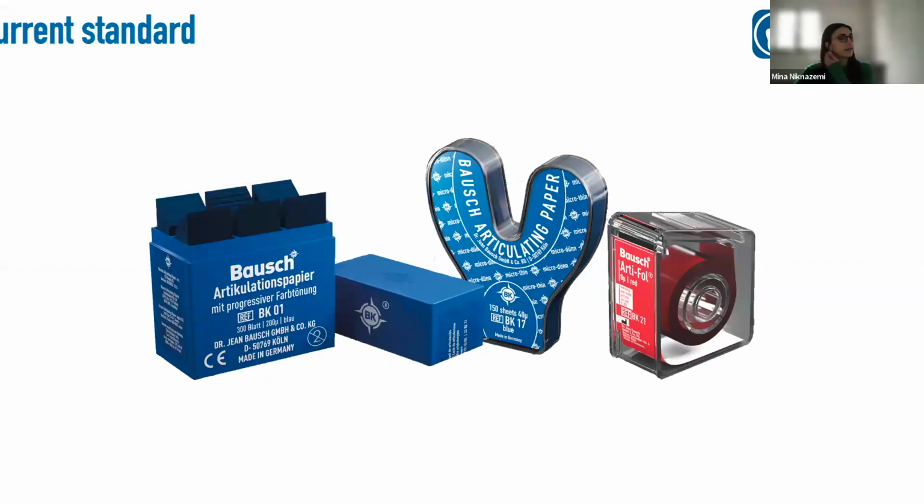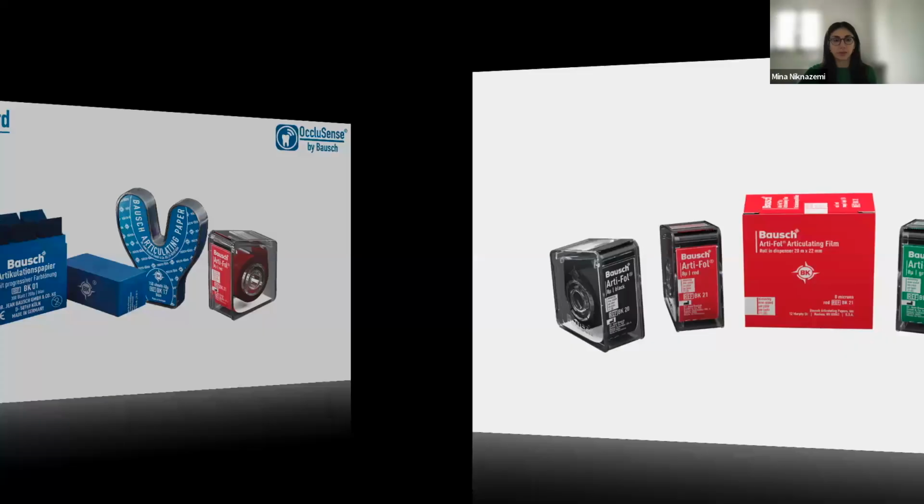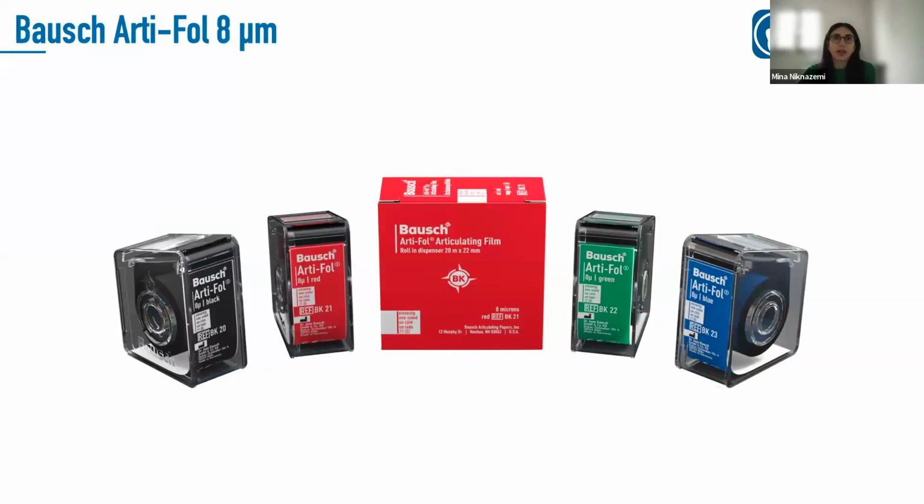We know that the current standard involves standard articulating paper in different shapes. You have pre-cut strips, you have occlusion paper covering the full dental arch, and you have occlusion paper rolled and ready to be cut in sizes as you wish. And obviously the different colors with various thicknesses, and the standard foil being 8 microns thin.